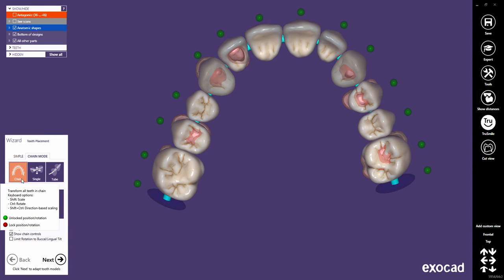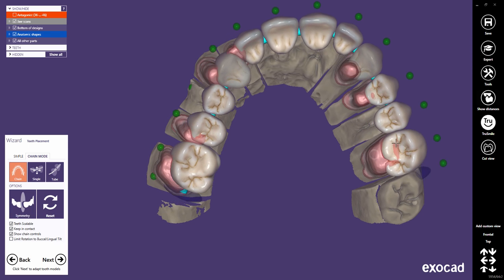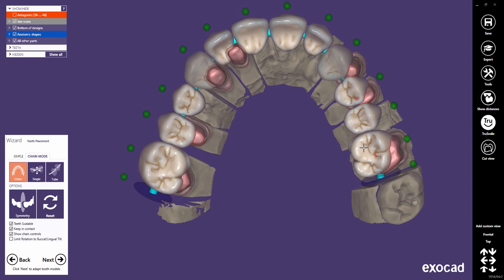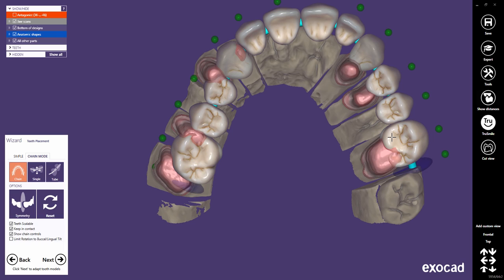Let's start with the Mode chain. Click any point in the tooth bow and drag your mouse to move the whole tooth bow in a chain.